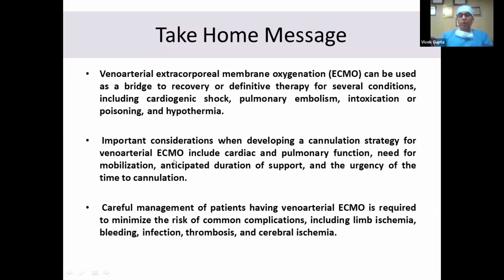Careful management of these patients who are on VA-ECMO is required to minimize the risk of common complications such as limb ischemia, bleeding, infection, thrombosis, and cerebral ischemia. And we have to make sure that there is adequate ejection by looking at the pulse pressure more than 10 so that we minimize the risk of LV distension and subsequent formation of thrombus.